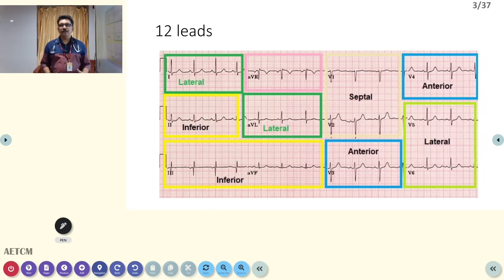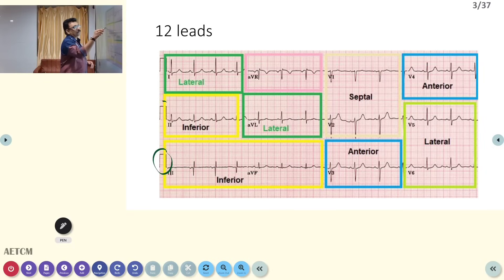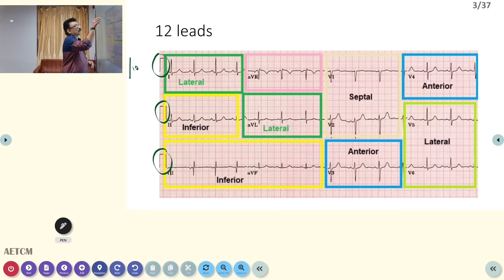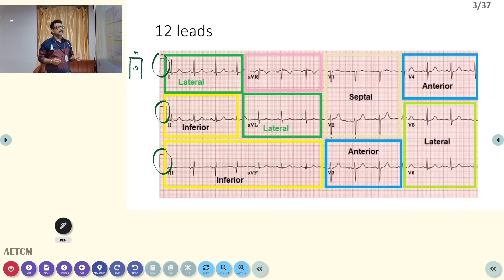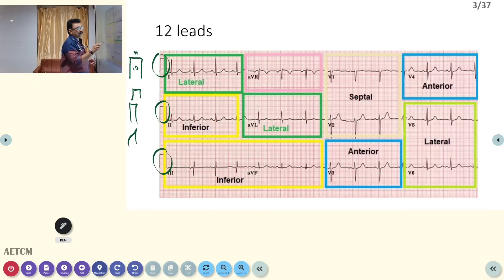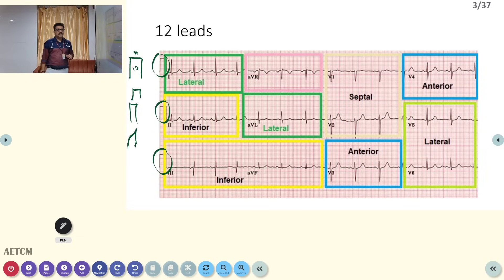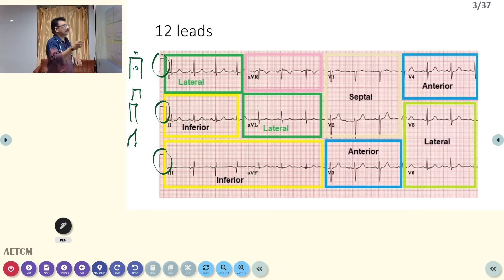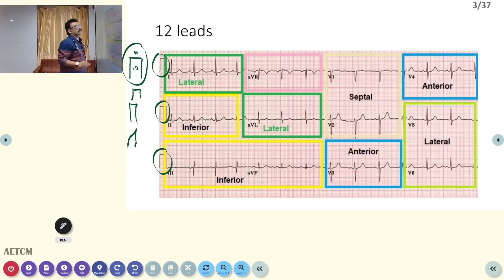When you take a 12-lead ECG, first check the standardization. The height of the standardization block will be 10 small squares, and the width will be 5 small squares. If the standardization is smaller or larger, or the format is distorted, you can have problems. Standardization is the most important thing to check in an ECG — normal standardization height is 10 small squares and width is 5 small squares.